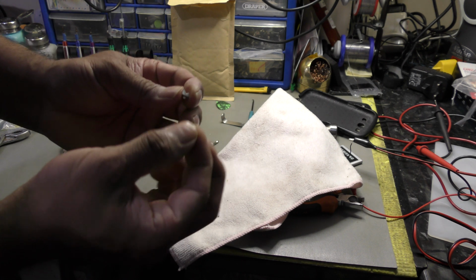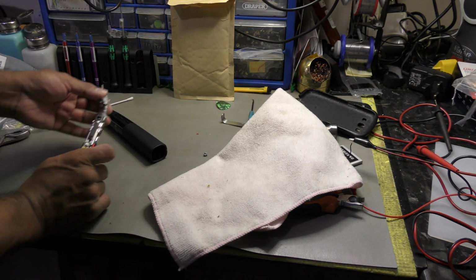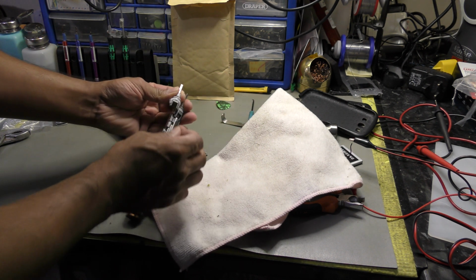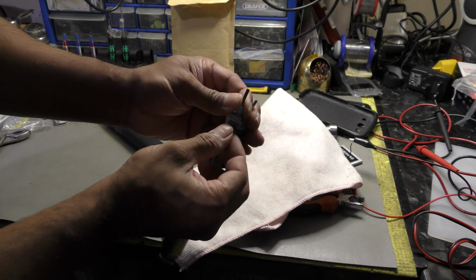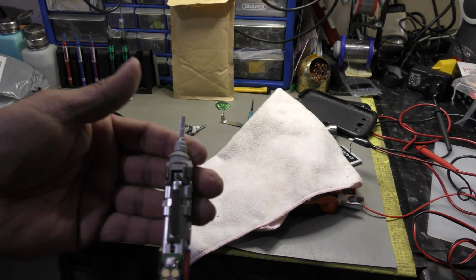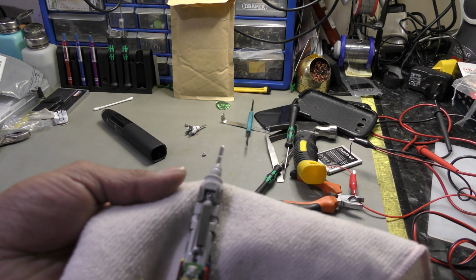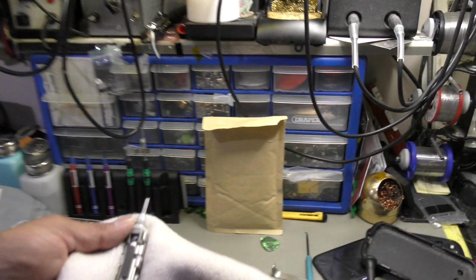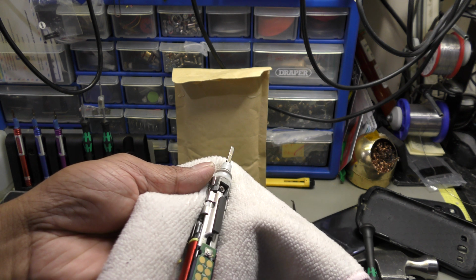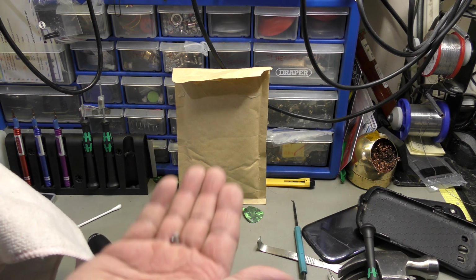And when you replace the part, just put a bit of red Loctite, sling it back in again, attach the part. Just remember the orientation, you can't go wrong. Attach this, and then put the screw back in through that way. But the orientation, again, should be as here. Okay, so hope you can see this. There's not enough light. Let me see if I can zoom in, and yeah, that's better. So that's the orientation of the screw, and the little brackets here, that one.